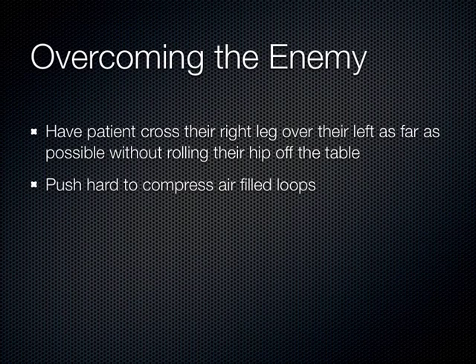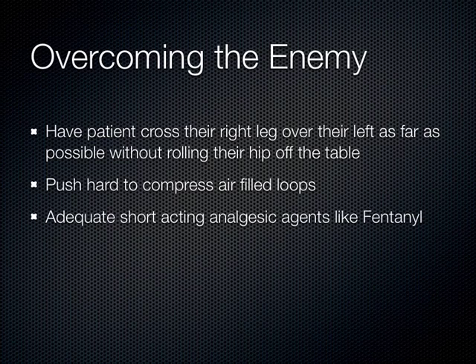You're going to push harder in the abdomen than you've ever pushed before with an ultrasound transducer today. But don't worry, the models are getting paid to tolerate that. They'll push you away if it hurts too much. We also are going to give the models fentanyl. We're going to give them narcotics today. Just kidding. No, but in reality, this is what you do, okay?